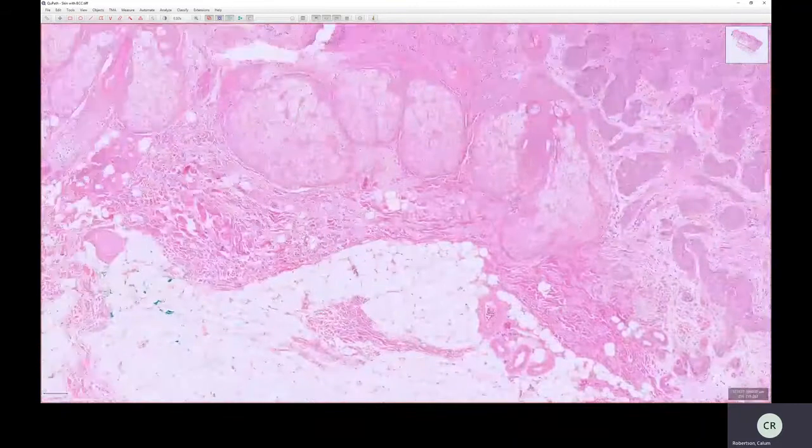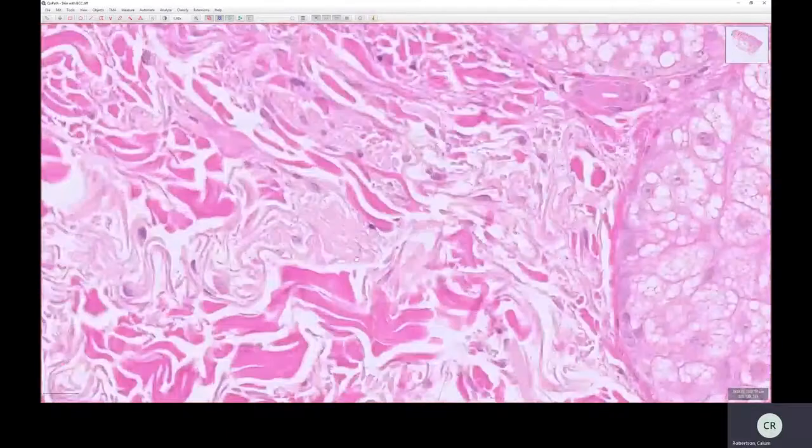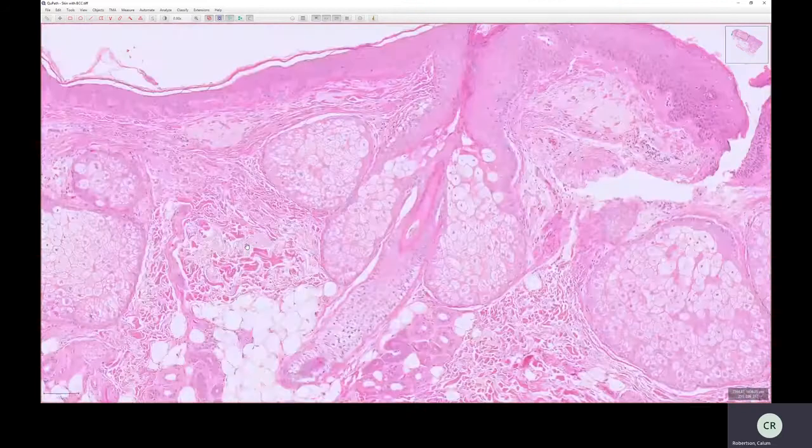There's another main type of tissue here, which is elastin. You get elastin fibers, which stain. Here's elastin fibers. These are the collagen fibers, because I can tell that these are bright pink. But these are elastin fibers because these are lighter pink. The skin has an elastic capacity, and that's because of the elastin fibers.